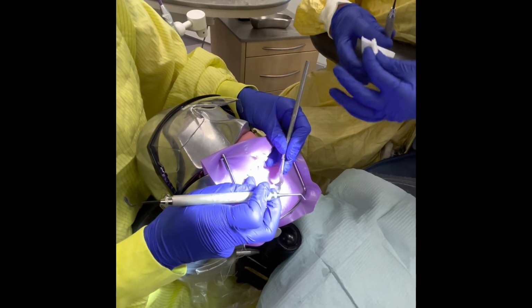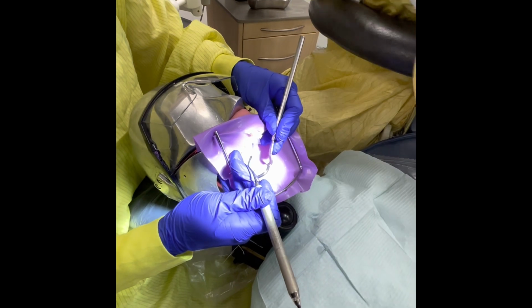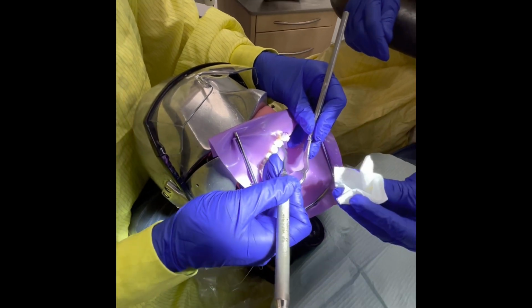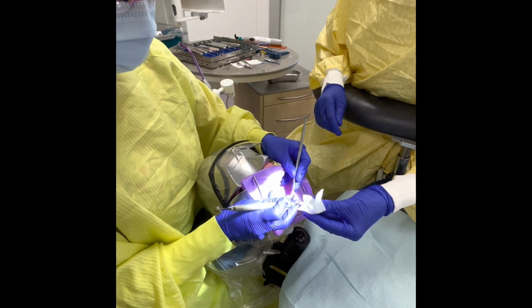The next instrument I'm going to take is a PFI, or flat plastic. As you can see, it's a paddle, okay? Stacy has passed the Teflon instruments. Some cassettes have a gold, some have Teflon. The important part is knowing that you just can't use the stainless steel instruments while using composite.